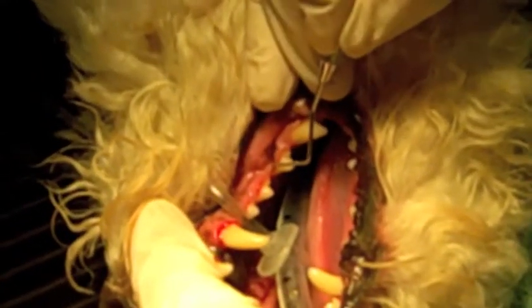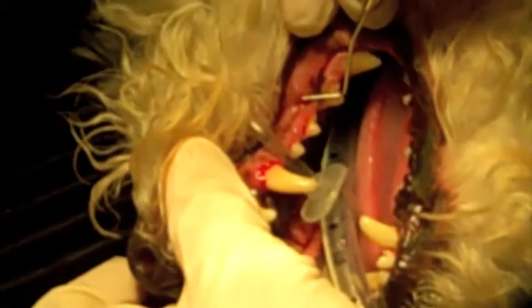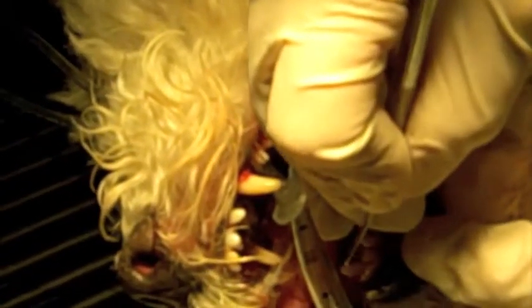Sometimes if there is something, the probe will go up under the gum line even to that depth, and then we have to evaluate what we need to do, if a tooth needs to be extracted or if there's any other course of action we can take other than that. So everything actually looks good in this mouth. We'll check the inside of the other side of the mouth. I don't know how well you can see that, but I'm going to just do the same thing inside.